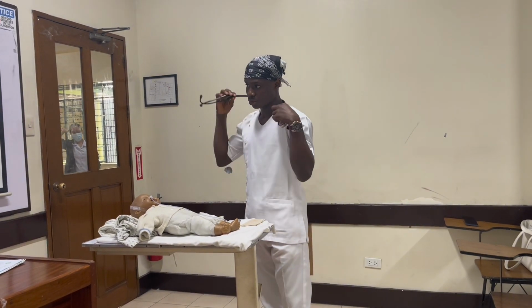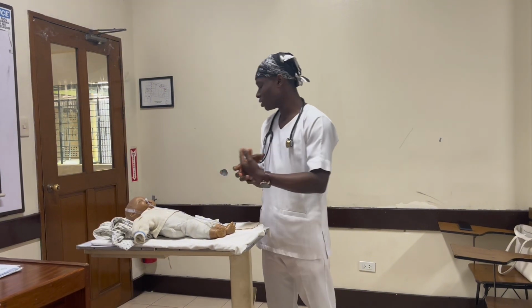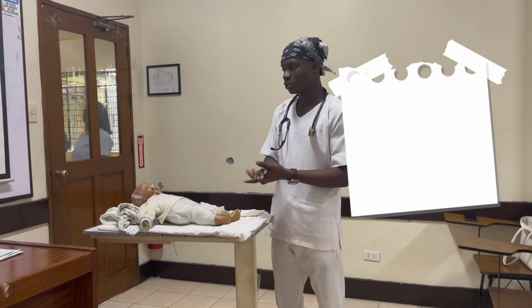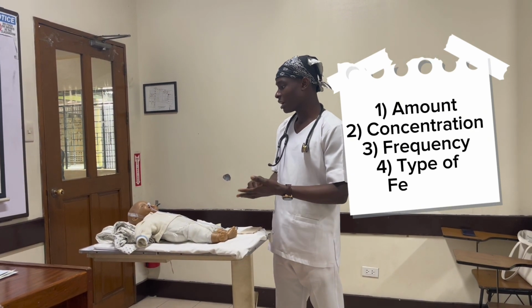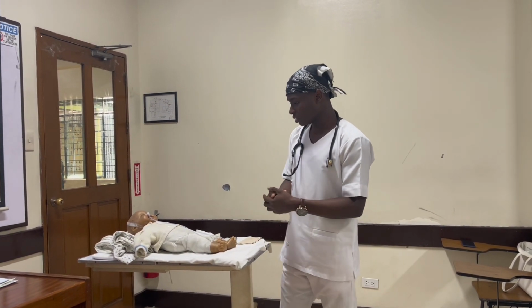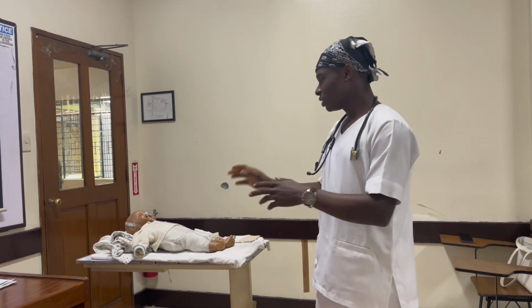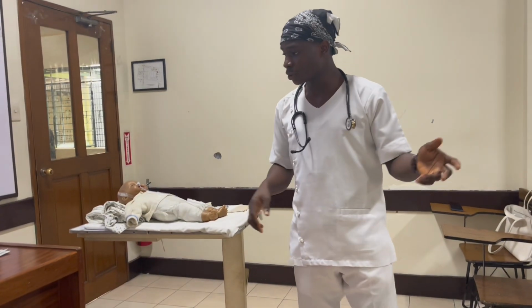So my stethoscope. Starting it, first of all, check the physician's order. After checking the physician's order, what is there to check? I check for the concentration, the amount, the type, and the frequency of the tube feeding in the patient's chart. Then after doing that, what is the next thing? The next thing is, the mother might not be in the same room with the baby. The mother is in another room. So what do I have to do there?